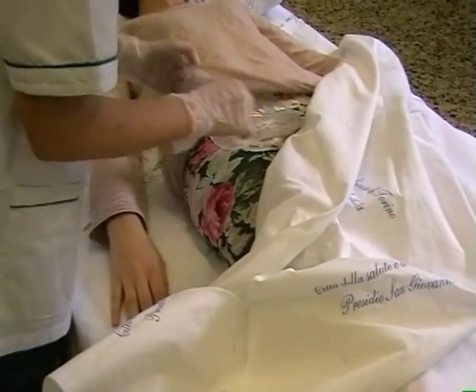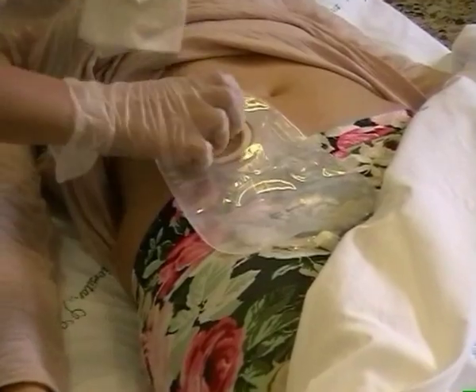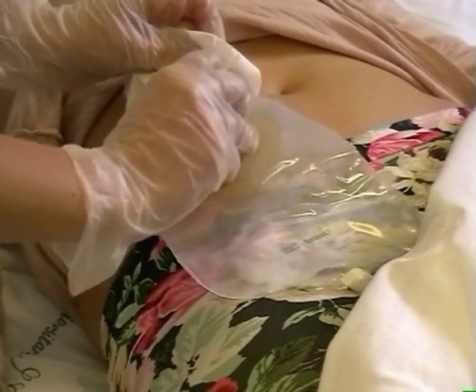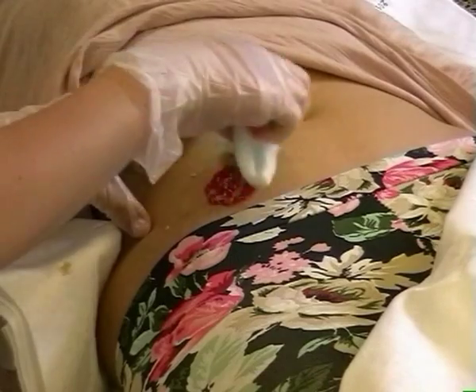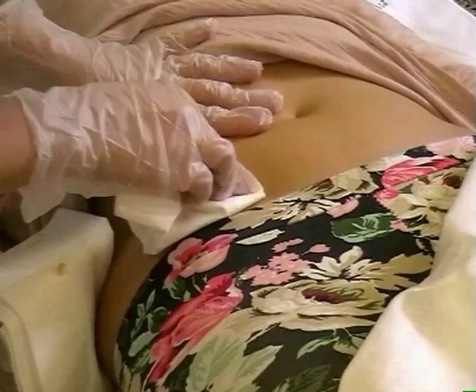L'infermiere scopre il paziente, toglie placca e sacchetto con delicatezza procedendo dall'alto verso il basso, deterge lo stoma e la cute peristomale procedendo dall'esterno verso l'interno, e asciuga stoma e pelle peristomale con un panno di carta morbido.